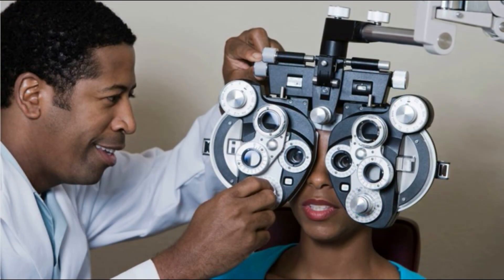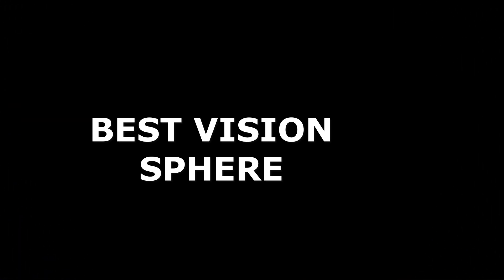At this point, this is your best sphere for that eye. Remember, you started with the right eye, so do the same procedure for the left eye until you get the best sphere for the left eye as well. I hope this video has helped you to know how to get the best sphere for each of your patients, one eye at a time.